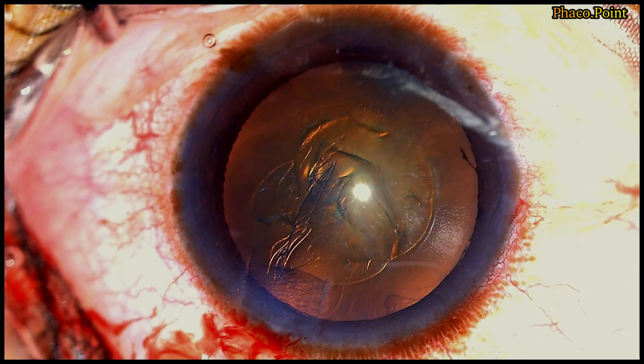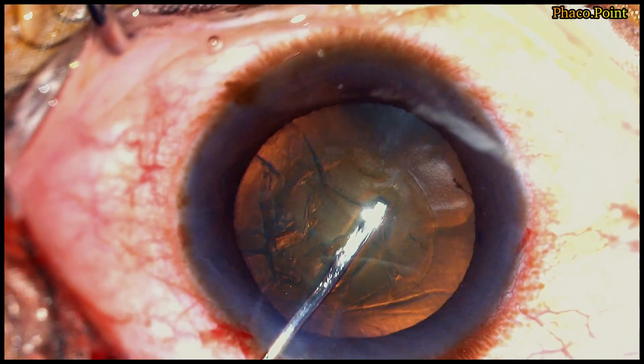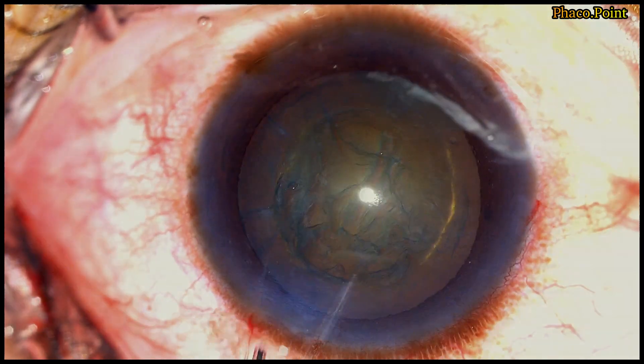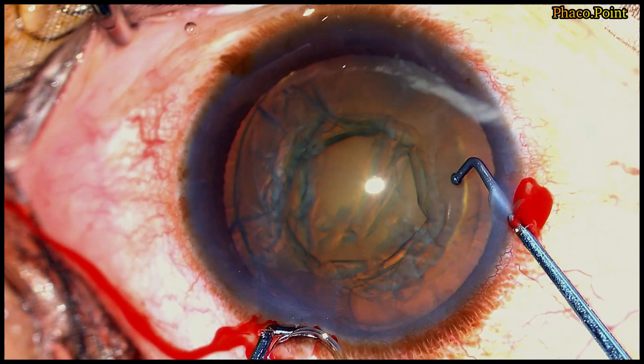Let's now move to the second case. This is another soft cataract with early nuclear sclerosis. You can see the hydrodissection taking place, followed by the hydrodelineation. This enables us to delineate the endonucleus that actually needs to be pre-chopped.